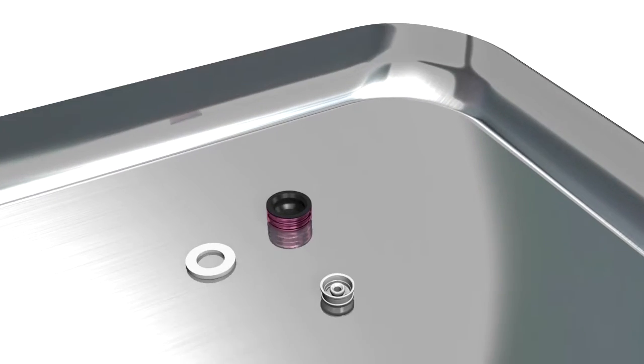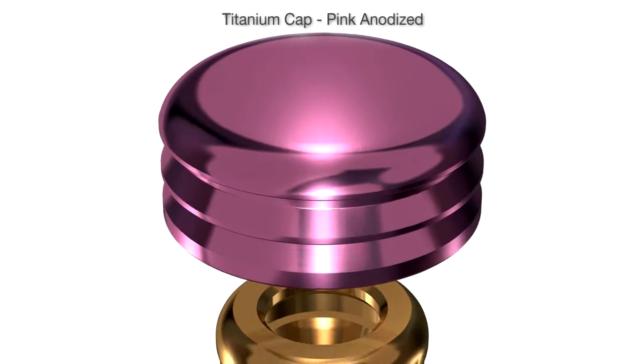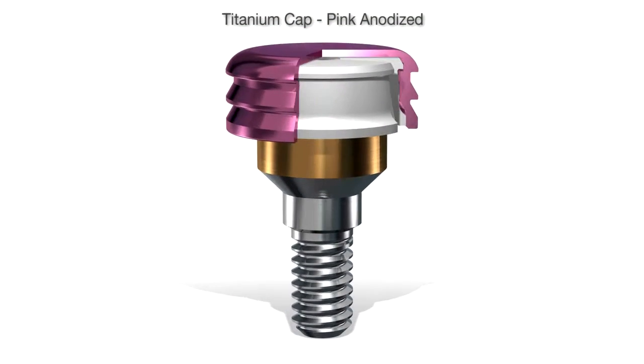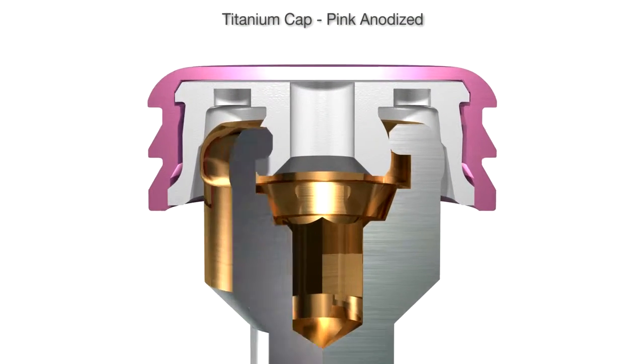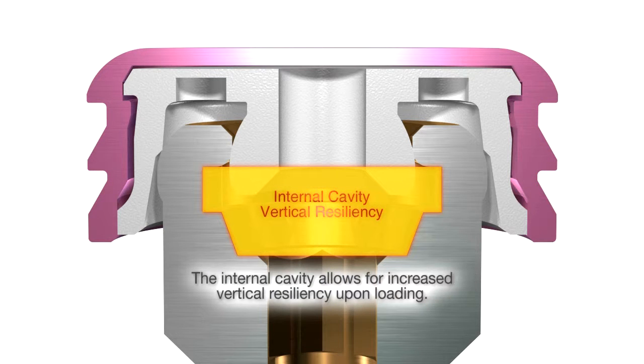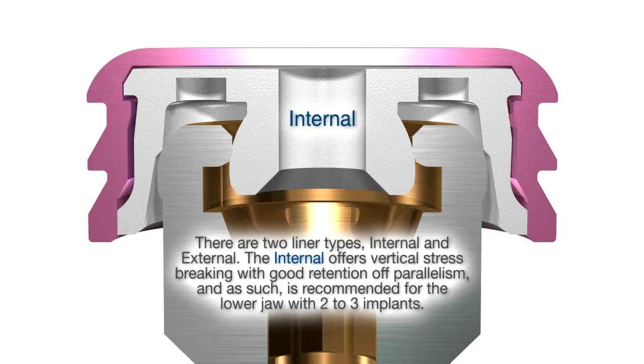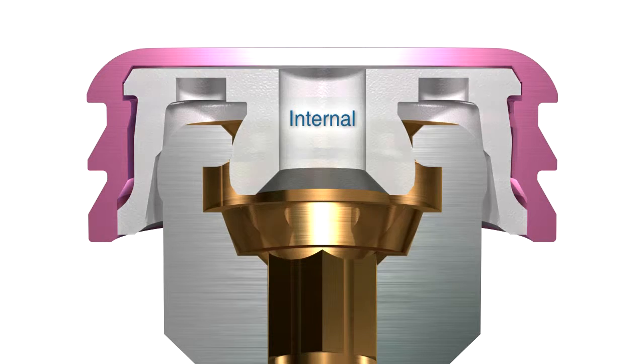Here's the attachments. They come with a black processing insert and liners with different degrees of retention. This shows the internal attachment, better retention than the Zest, anodized pink, a space in here for this ball to move up and down. This is the internal liner. It's recommended in a lower edentulous jaw with 2 to 3 implants.